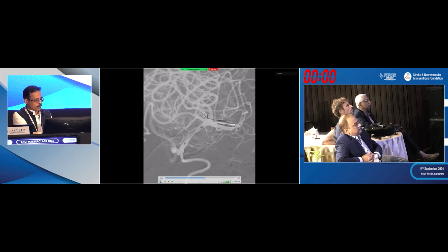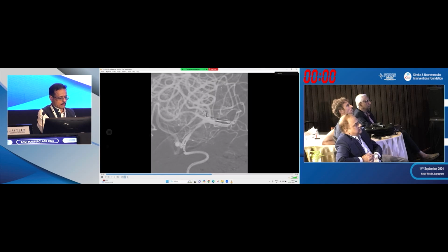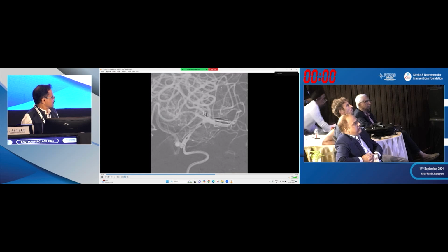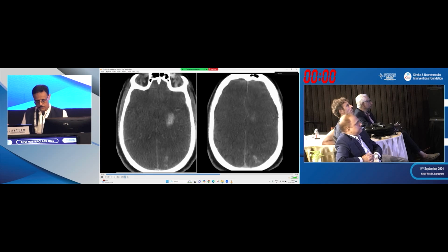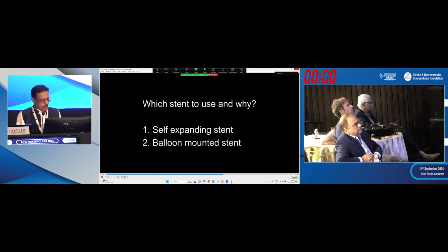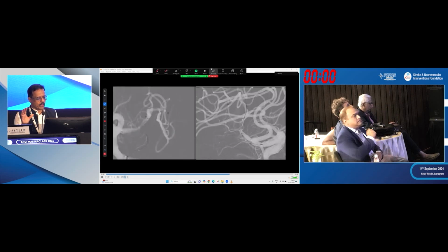It's great to have your guiding up there at the bifurcation, if one can see this thing. All right. You can't get the marker in. And have guiding right at the IC bifurcation, as one can see there. All right. So what we did is a CT before doing the stent, just to see if there's too much enhancement or no bleed at that point of time.